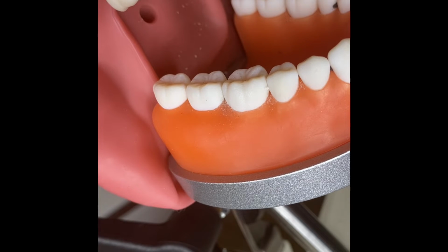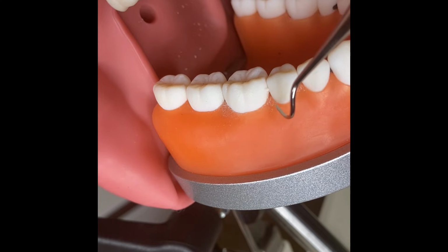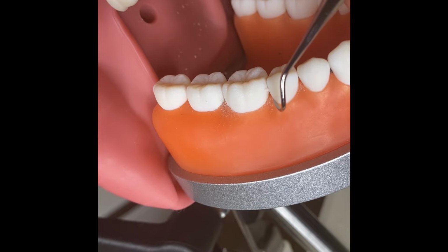The posterior sickle scaler is also a supragingival instrument only, so we will go 1 millimeter subgingivally at most. Again, at the distal buccal line angle of number 29, side to side, pivot, roll. Once halfway into the interproximal space, we go up, down, down.